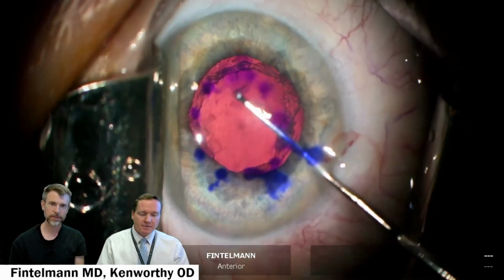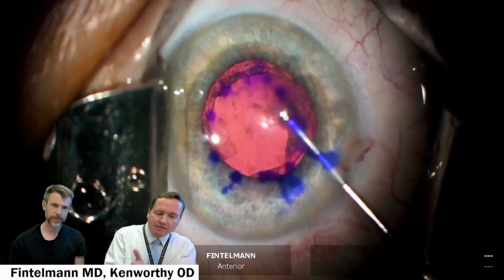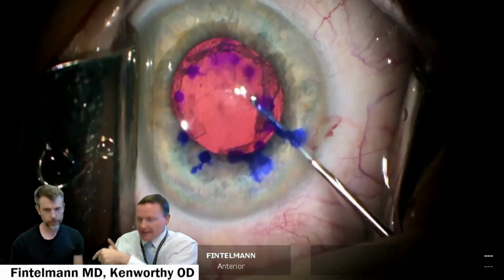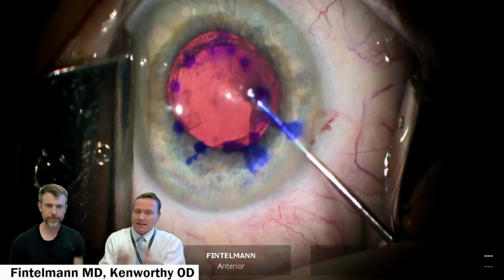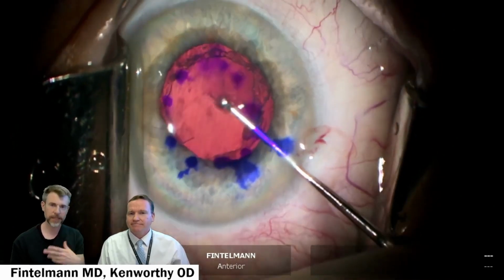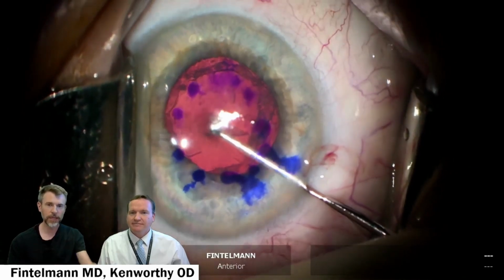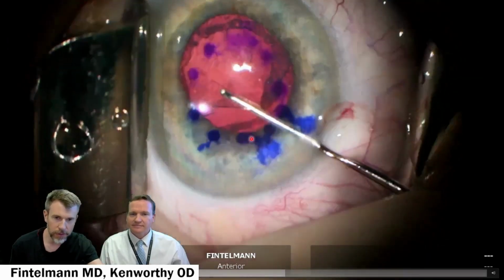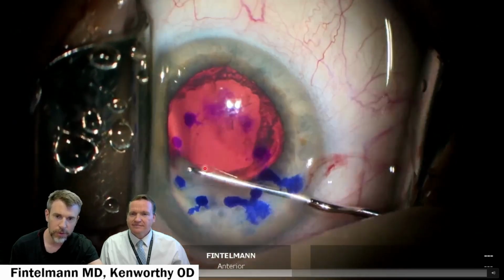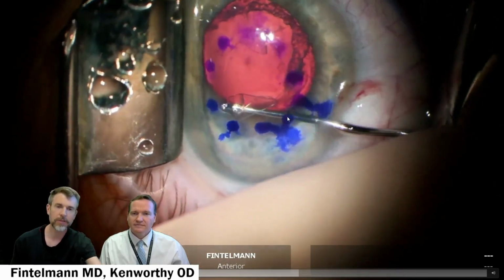I get questions sometimes from students with something like a Descemet stripping only, and they say, well, Descemet, isn't that part of endothelium? And yes, Descemet's layer is the basement membrane of endothelium. So you take one, you take them both. Correct. So we focus on Descemet because that's the part I actually affect and treat. But yes, we are taking endothelium with us at the same time, just like you said, because it rests on top. And here it's literally peeled off slowly. This is when I'm happier because I can just remove this and not as concerned. It's almost as similar to a rexis in the sense that it's peeled around and removed in one piece.